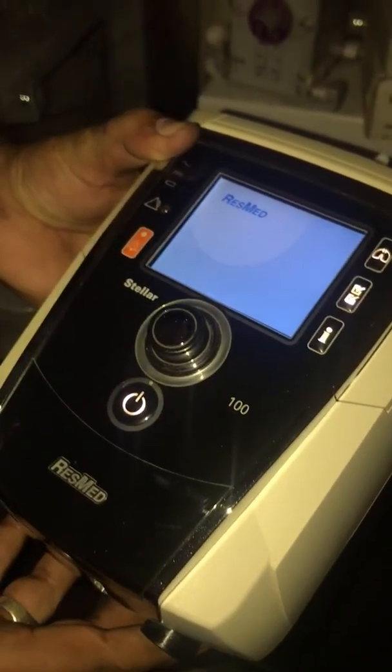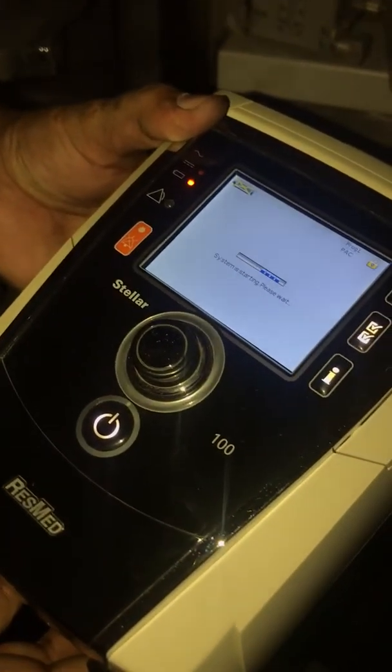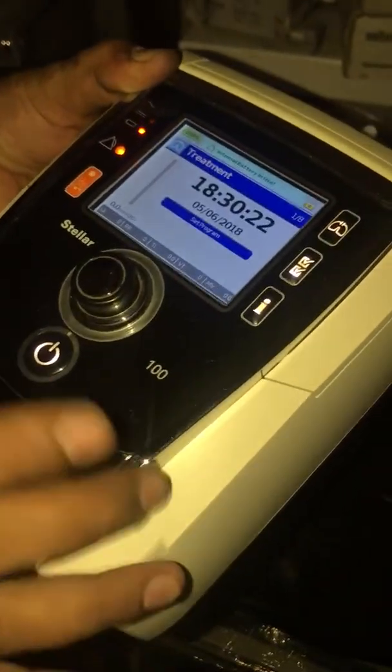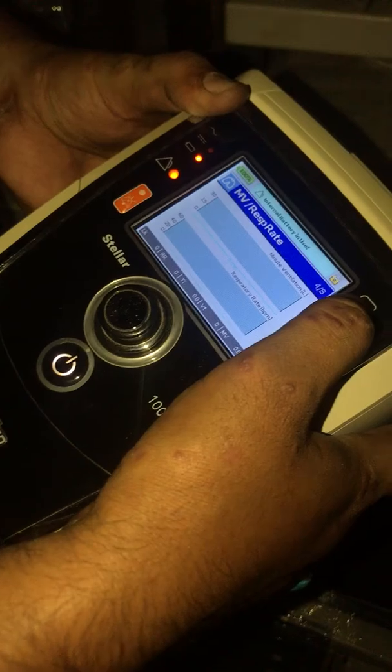This is the humidified chamber and oxygen port. We can adjust the FiO2 from the device. All of this can also be displayed as a graph, including Minute Ventilation.